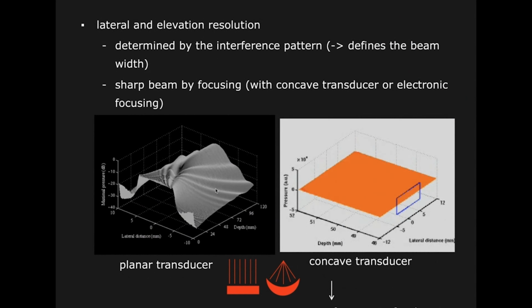And when you really look at the pulse shape, you see that the shape of the wave that we send out, because we have to use the transducers and do this kind of focusing and use these different crystals to create this ultrasound field, is not that clean in that direction. The ultrasound field is not that clean.